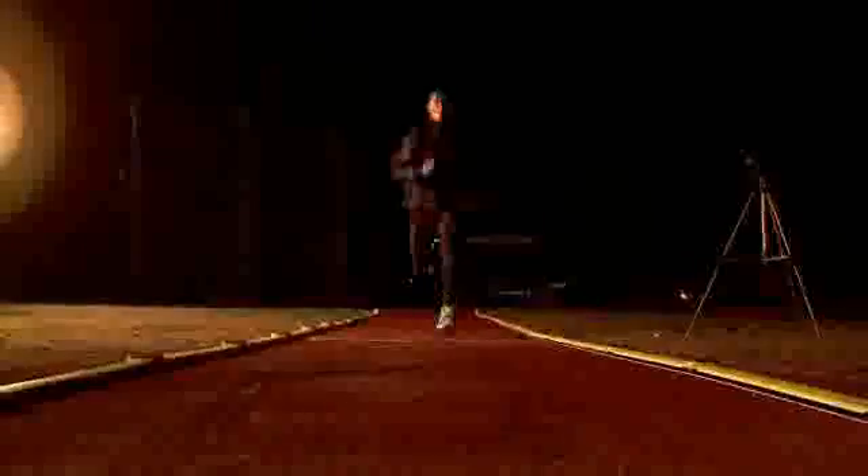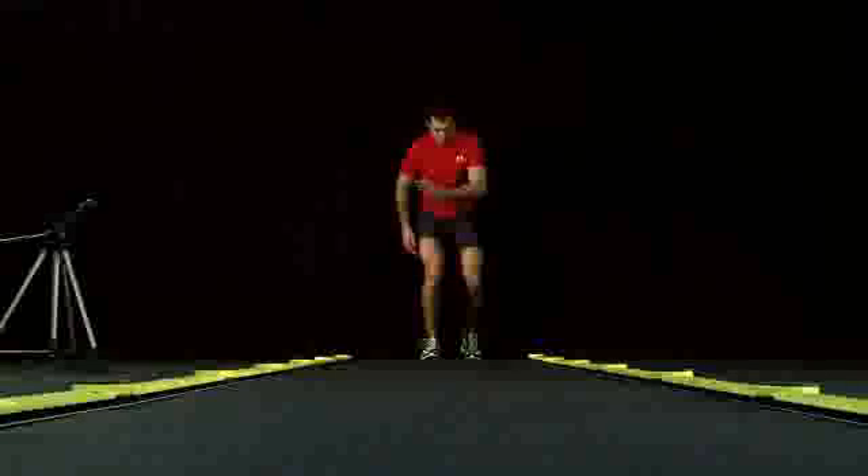The modular system is the most important part of the system. It is the OptoJump Next configuration with which you can analyze a walk, a run, or specific movements. It also allows you to evaluate complex exercises such as shuttle tests and the like.